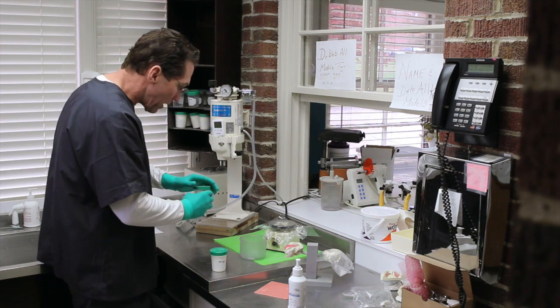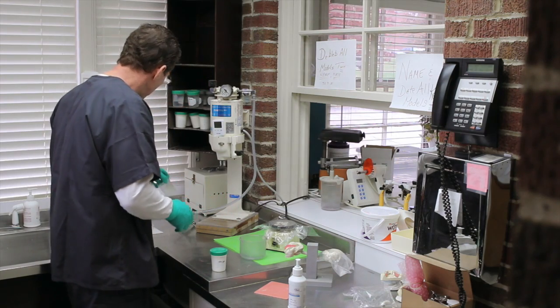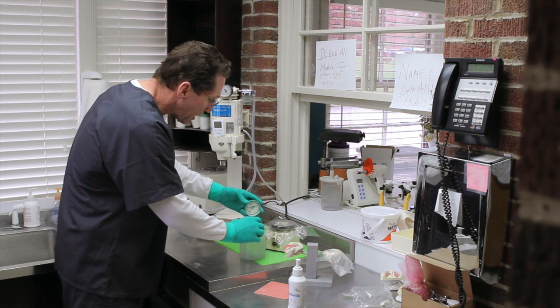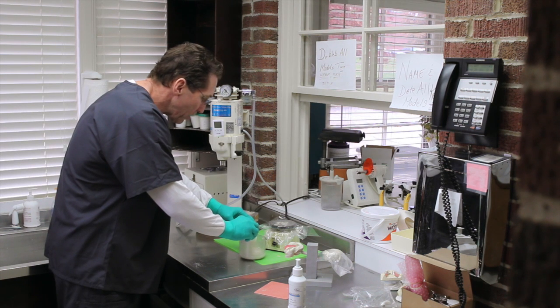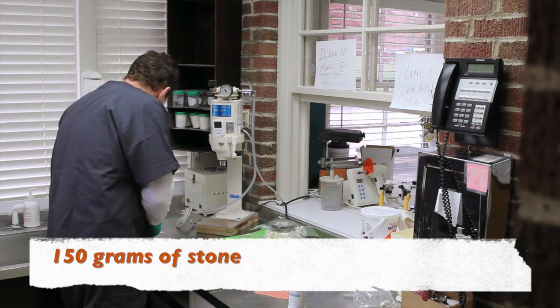So we're going to start with our water, 45 milliliters of water. And to that we're going to add, and these, by the way, are urine specimen cups, and I promise you these are not used. We got these new from a local drugstore, and they're perfect for holding just the right amount of stone if you fill it up completely, but again, we still do pre-measure and weigh it out. It's 150 grams of stone.